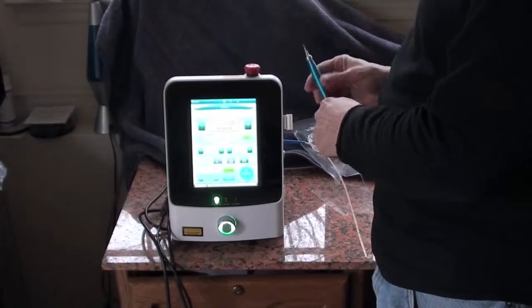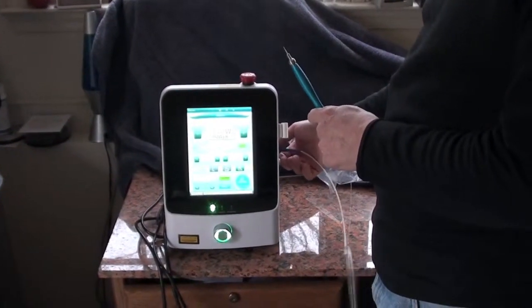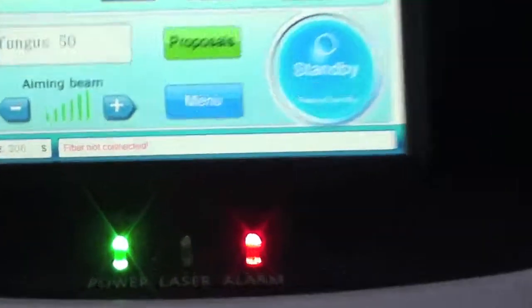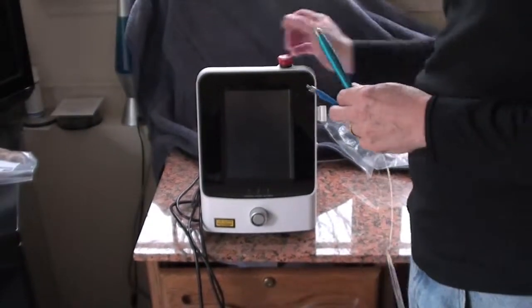So if you were to accidentally take this off, and I don't recommend doing this, you never should take off any of the attachments with the laser on, because watch what happens. See how the alarm goes on? It says fiber not connected. So you always want to shut off the machine.